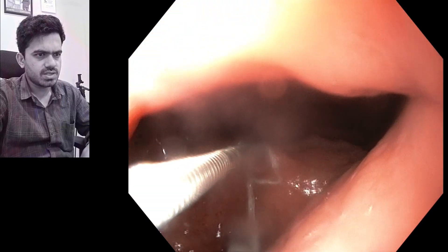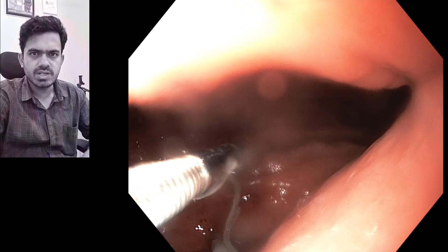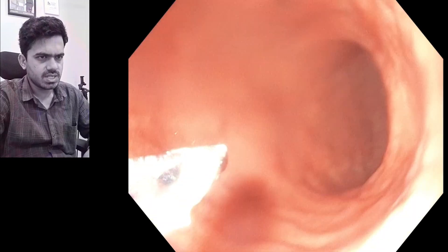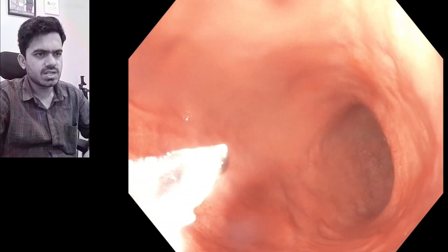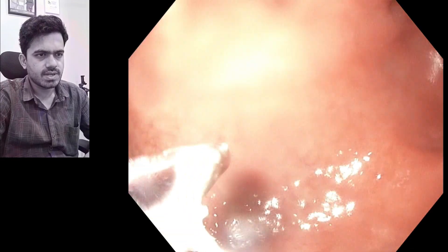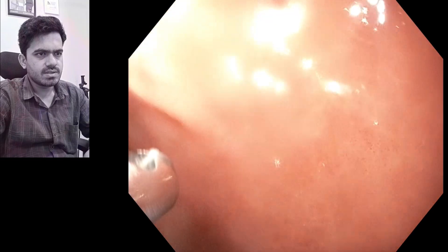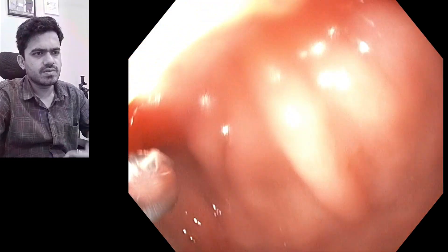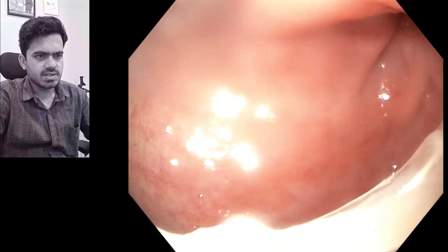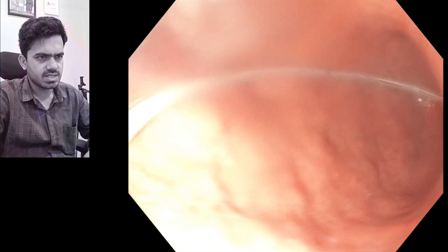We have tied a thread to the tip of the tube so that we can get hold of it and put it in the desired location. We are going to take it and put it in the intestinal region. The thread is going to eventually come out when we are pulling the Ryle's tube out, and here the tube is in place.